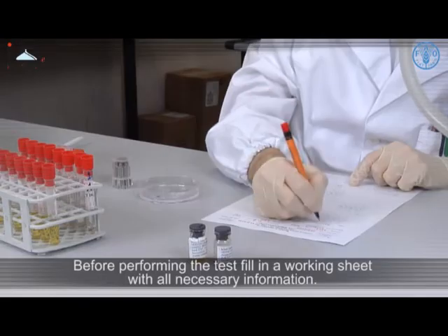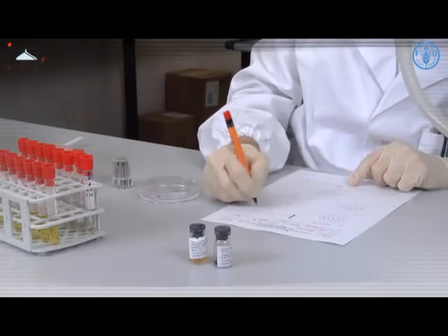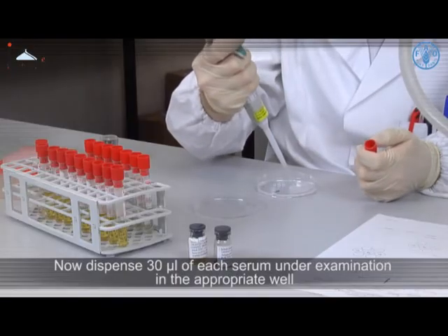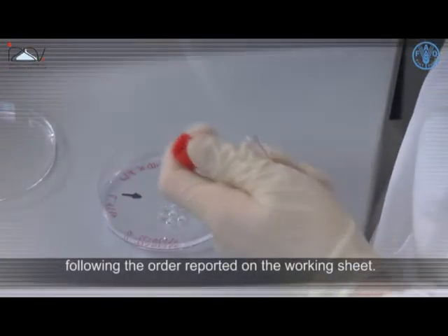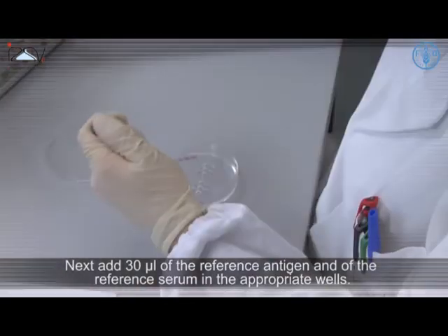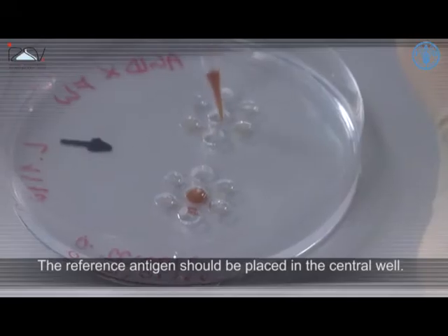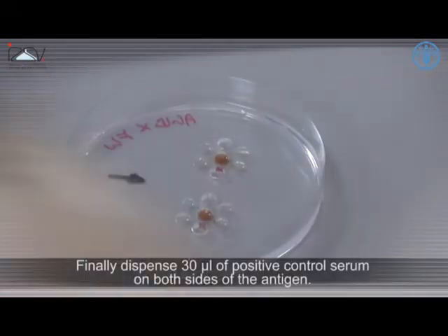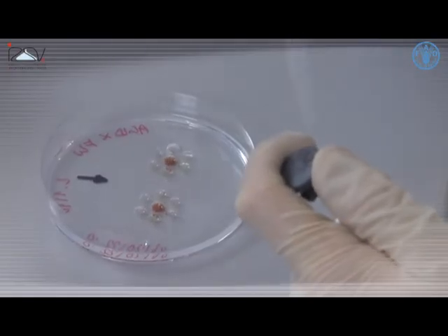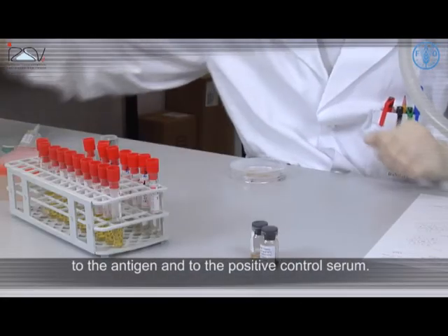Before performing the test, fill in a working sheet with all necessary information and identify the dishes with a marker. Dispense 30μL of each serum under examination in the appropriate well, following the order reported on the working sheet. Next, add 30μL of the reference antigen and of the reference serum in the appropriate wells — these are the positive controls of the test. Be careful to use the correct reagents for AGID. The reference antigen should be placed in the central well. Finally, dispense 30μL of positive control serum on both sides of the antigen. This scheme allows for all test samples to be simultaneously adjacent to the antigen and to the positive control serum.